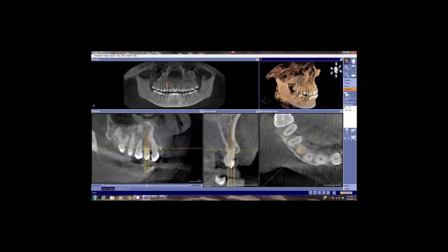Now, this type of bone grafting that has to be done in this case would be very predictable because this implant now is located within the bony housing. As you can see, there is a facial fenestration that will ensue upon placement of the implant in this position, but we have very nice thick crestal bone, and that apical fenestration is easily graftable and can be easily managed surgically.